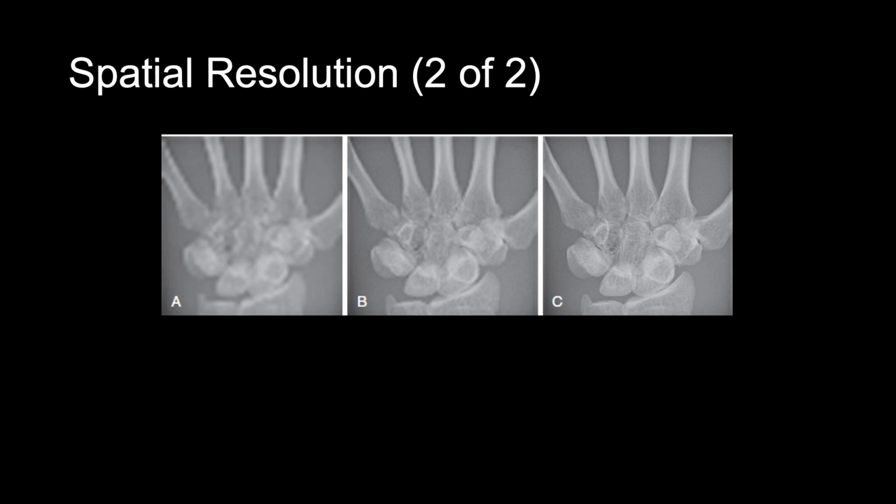So if you were to pick one of these images to send to the radiologist, which one would it be? I would pick image C, the one with the most spatial resolution. That's more of a diagnostic quality image to send to the radiologist.